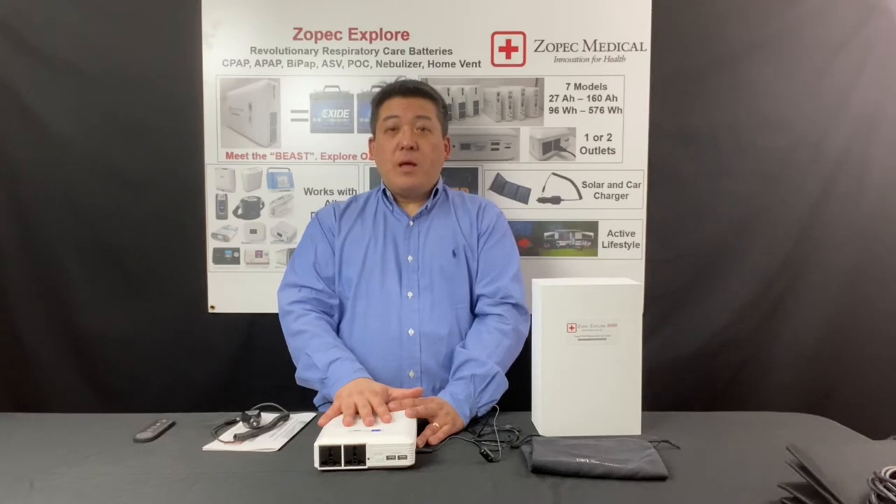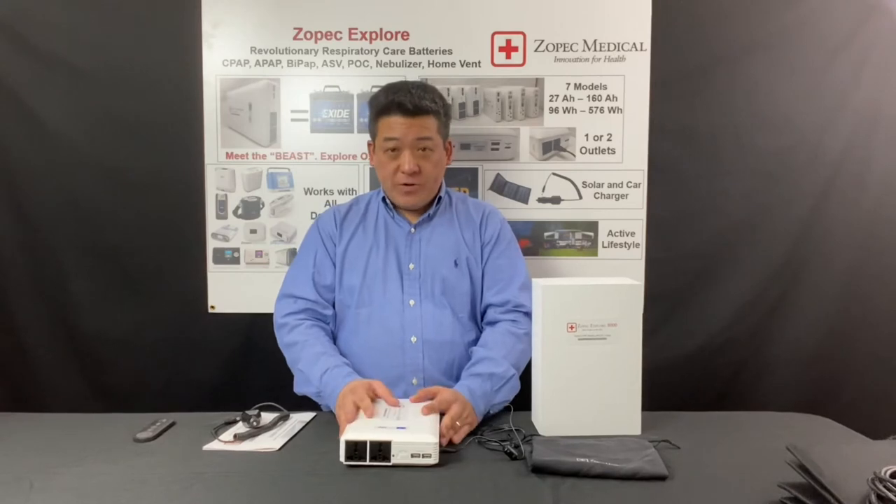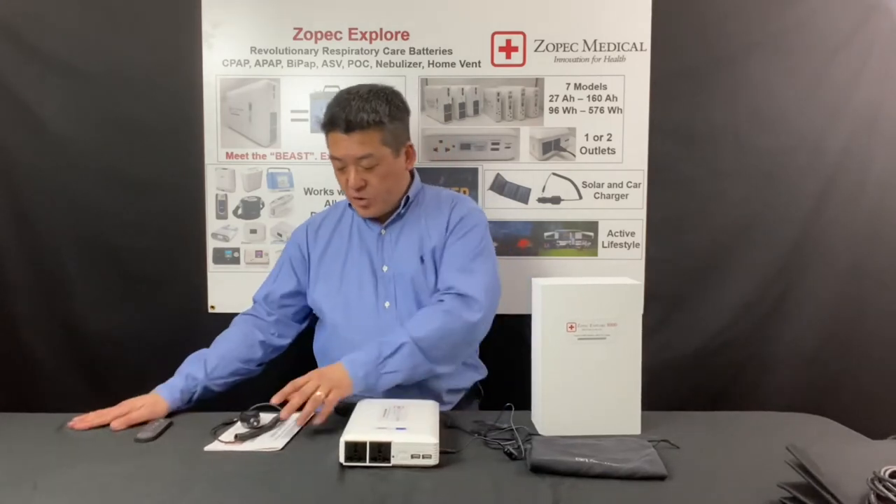After it's fully charged at 100%, it will indicate FF, which stands for full. So after it's fully charged, you're ready to use the battery to run a CPAP machine. Let me do a demonstration.